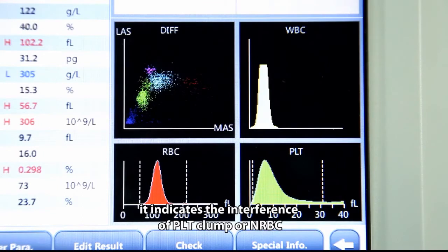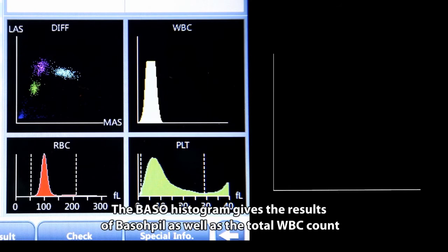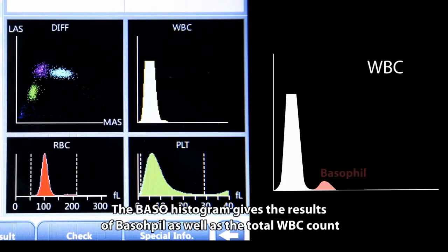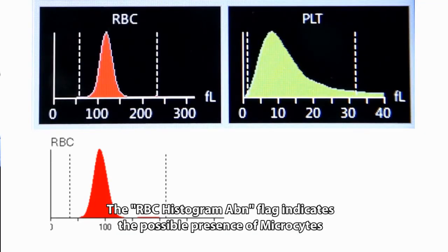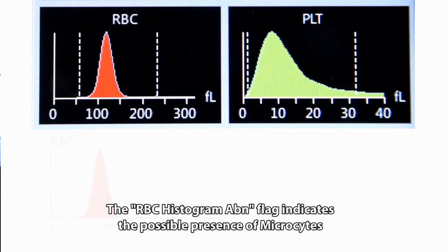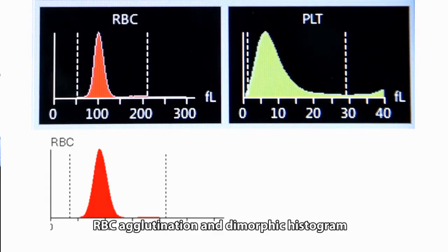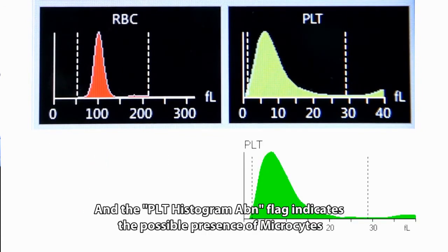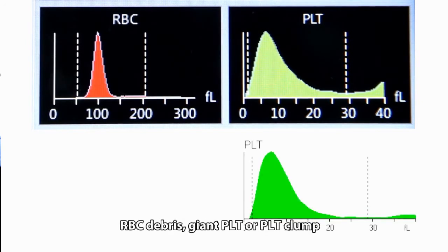A WBC abnormal flag may also indicate interference from PLT clumps or NRBC. The baso histogram gives basophil results as well as the total WBC count. The RBC histogram ABN flag indicates the possible presence of microcytes, macrocytes, anisocytosis, RBC agglutination, or dimorphic histogram. The PLT histogram ABN flag indicates the possible presence of microclots, RBC debris, giant PLT, or PLT clumps.